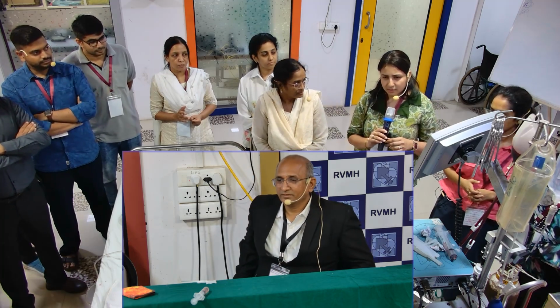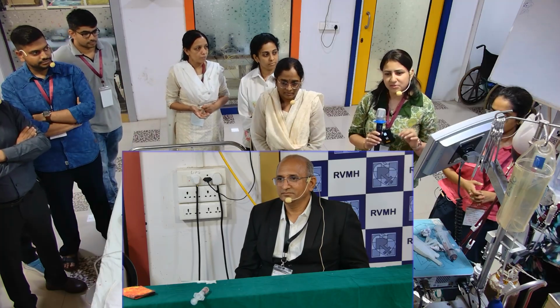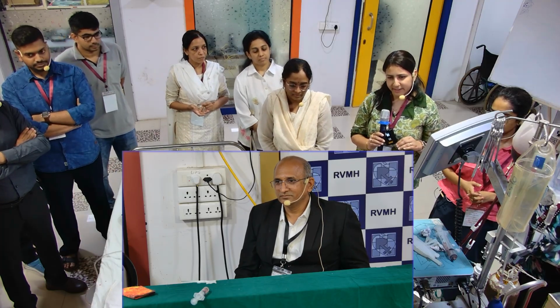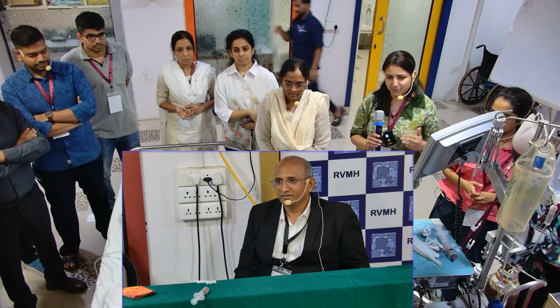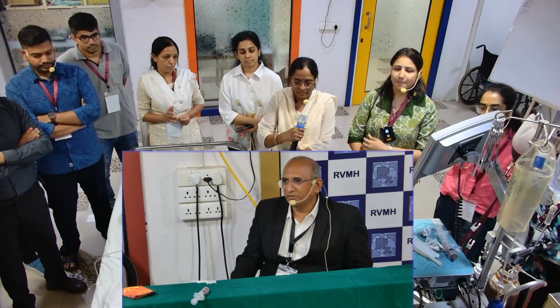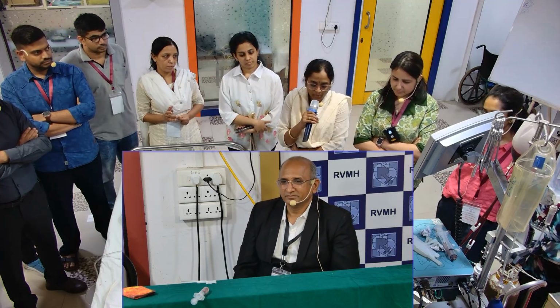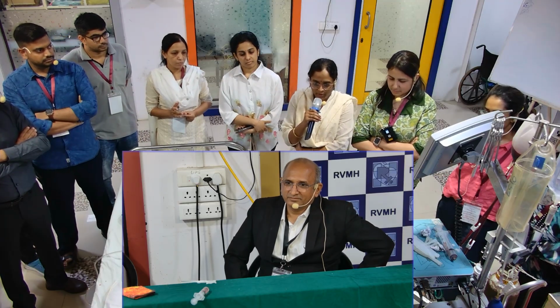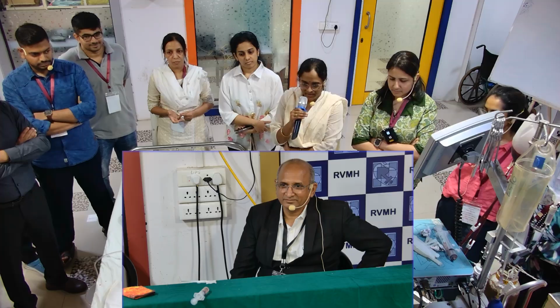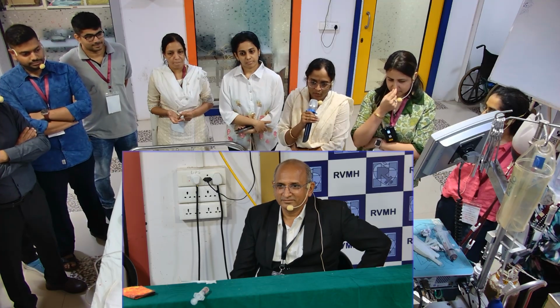So once the cause is identified, try to troubleshoot from the very basics of that same cause rather than in an unsystematic way. Rather than jumping, once you know that it's a sweep gas failure, then you have to concentrate more on sweep gas. The problem can be a very minute thing, which can cause a bigger issue. So everything should be taken care of or focused.